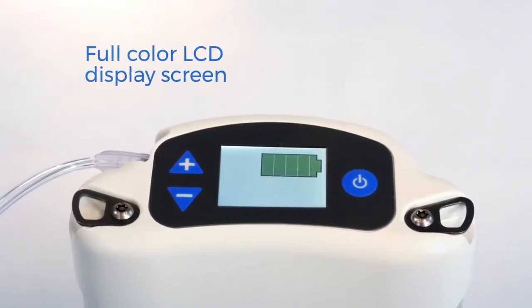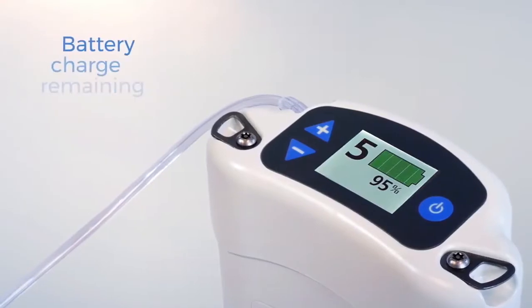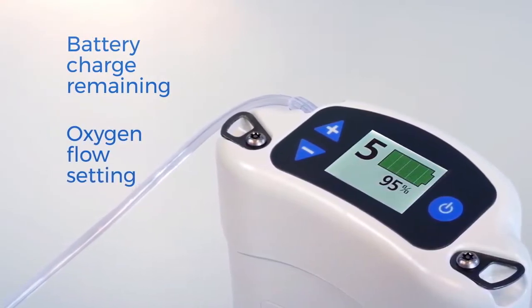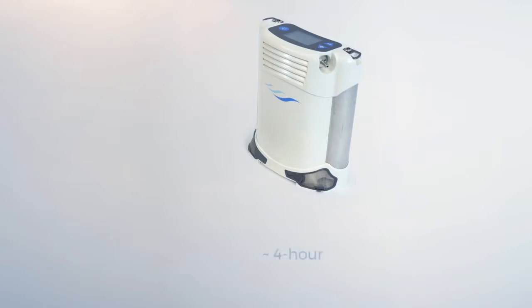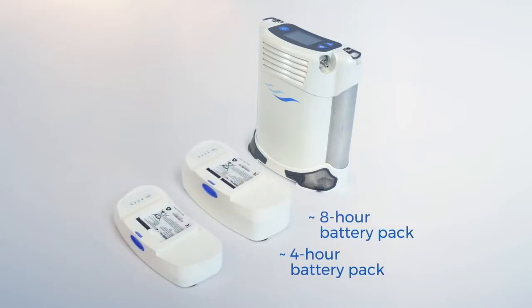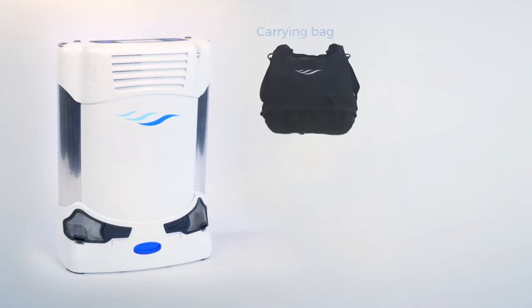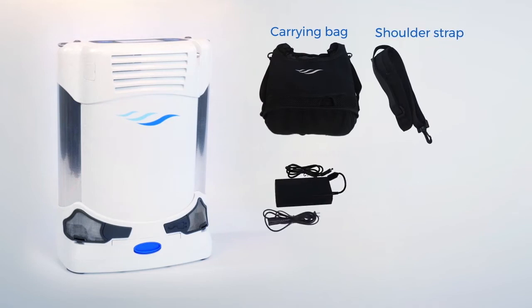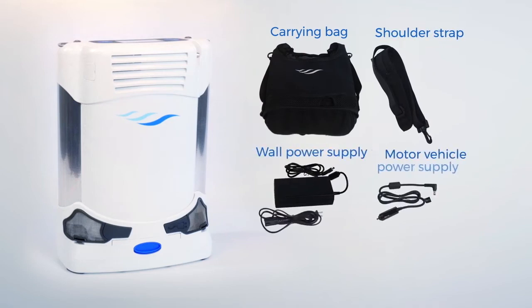A full-color LCD display screen shows remaining battery charge and oxygen flow settings so you can always monitor your machine. Packaged with a standard four-hour battery pack or an optional eight-hour battery pack, the Freestyle Comfort provides hours of mobility for an active lifestyle. It also comes with a durable carrying bag including a back pocket and shoulder strap, AC wall and DC motor vehicle power supplies, and a seven-foot cannula.